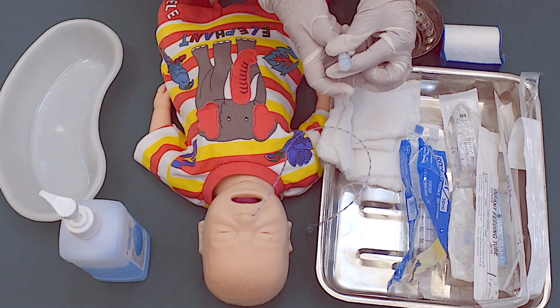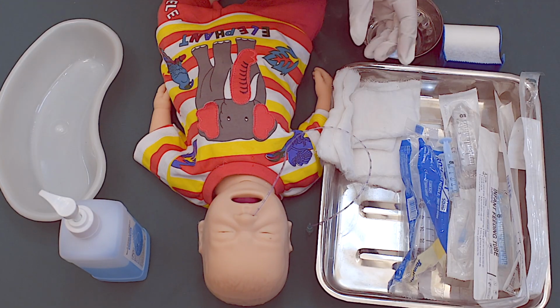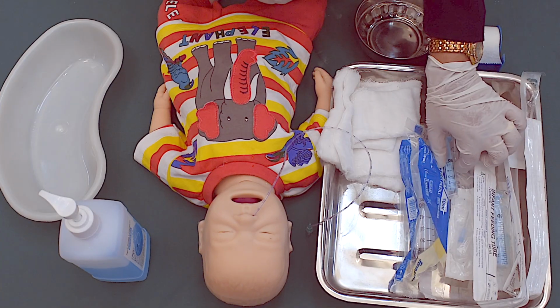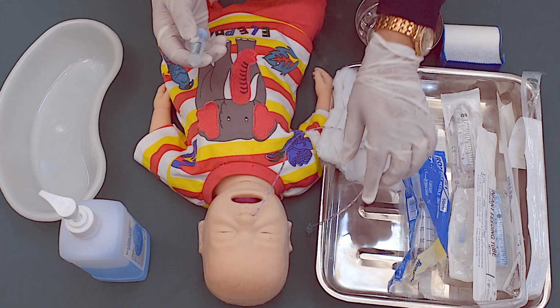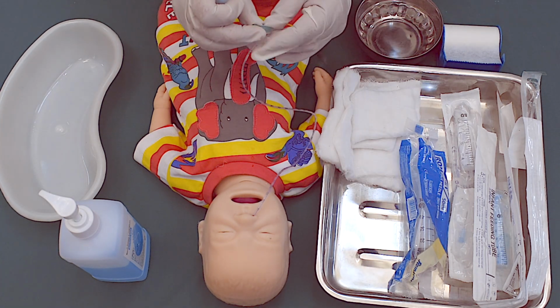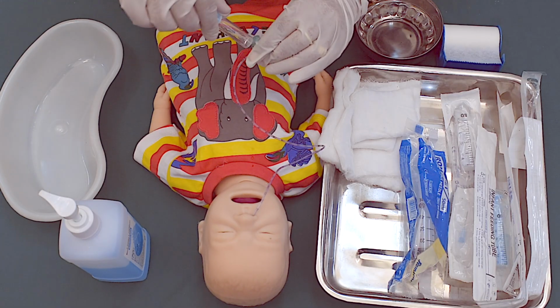Another method that we can use to check the placement of the tube is by inserting a small amount of air into the abdomen. Fill the syringe with around 5 cc of air. Put a stethoscope and push the air through the tube.